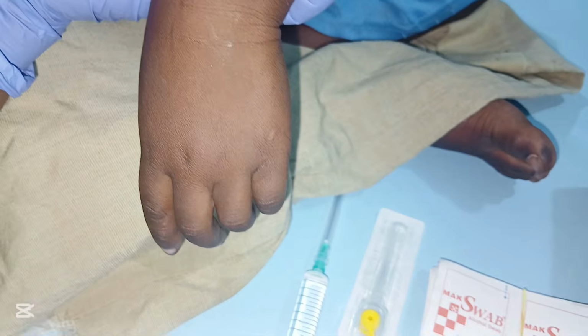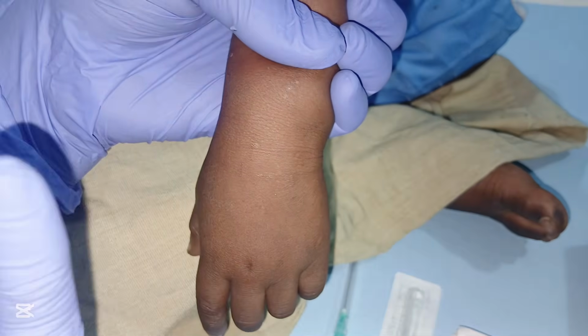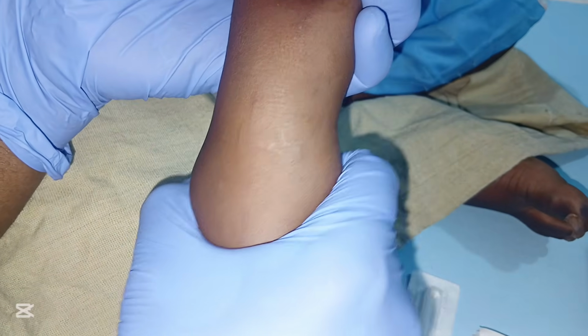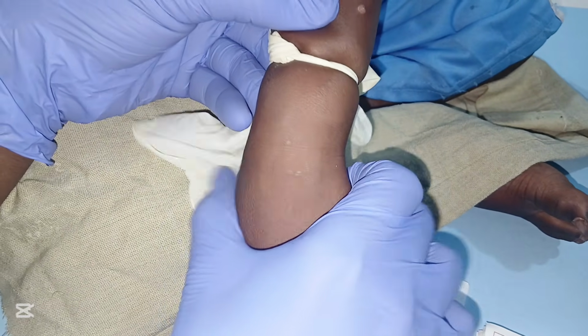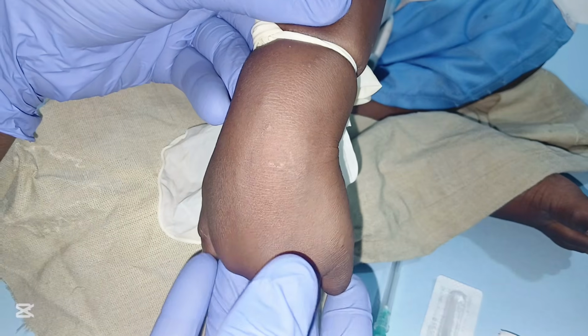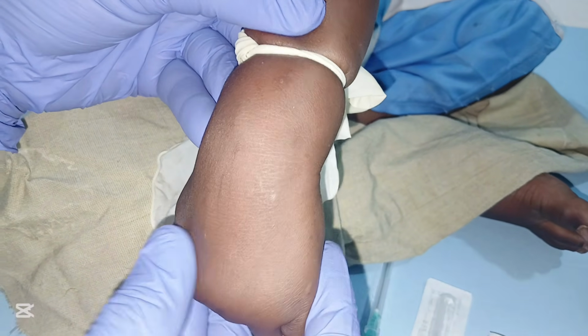Before you start, make sure you gather all the necessary supplies that you need to perform the procedure. Then first make sure you place the child in appropriate position. Then you get the child's hand. First make sure you apply a tourniquet. Then you have to do proper retraction of the skin. Make sure you retract back the skin for the vein to be visible for you.